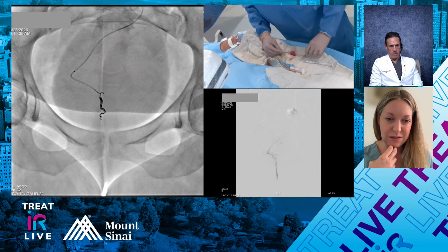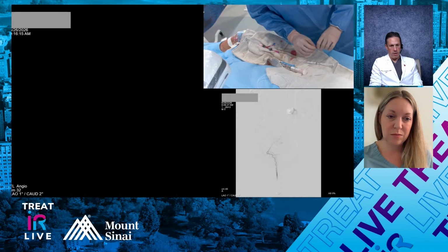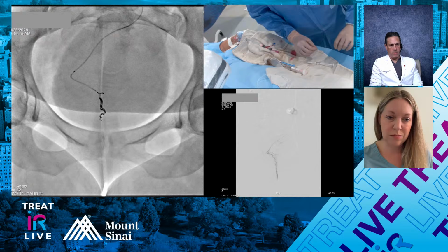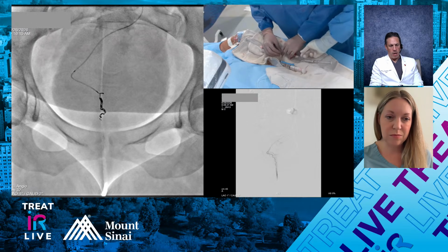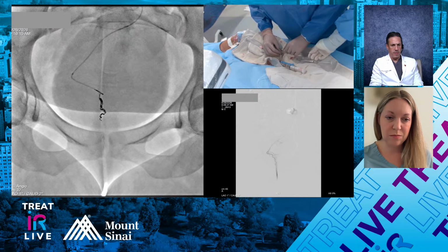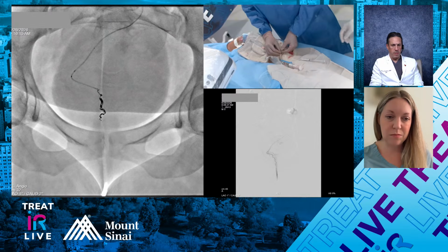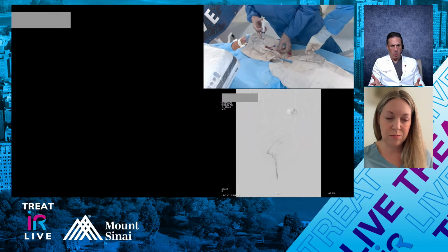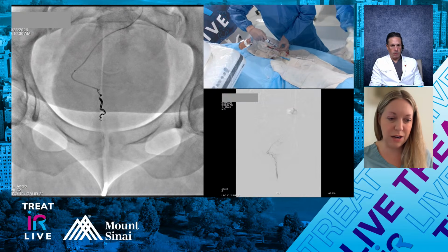I agree with Jay's assessment about the non-soft coils. They're great coils as well, but I don't think you necessarily need fibered in this location. I think it's really important to get a dense pack. I don't know of any other peripheral coil that packs this tightly. This is really just a great result for one coil. I don't think you need to put any more in, to be honest. No, I'm not going to put any more in.